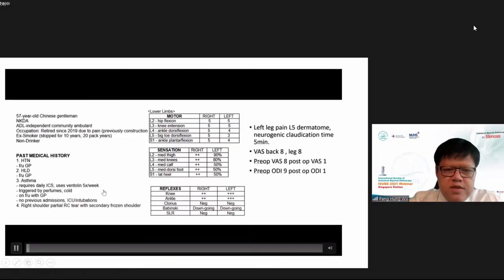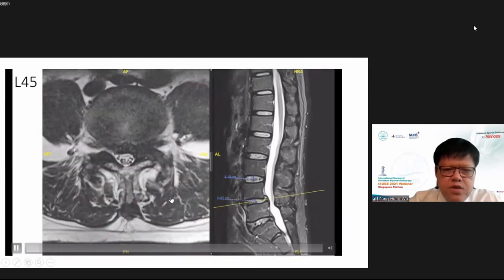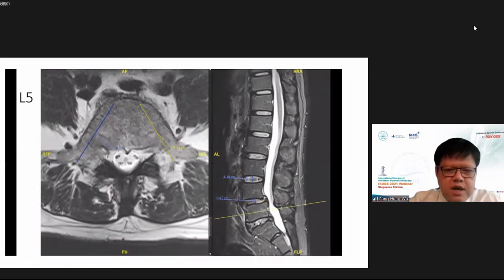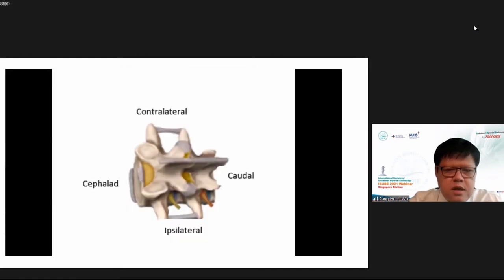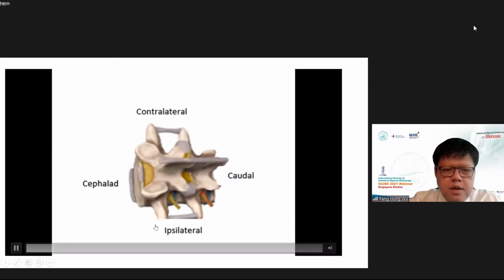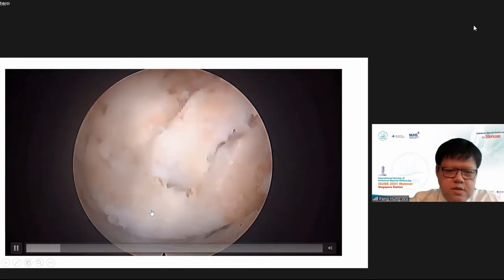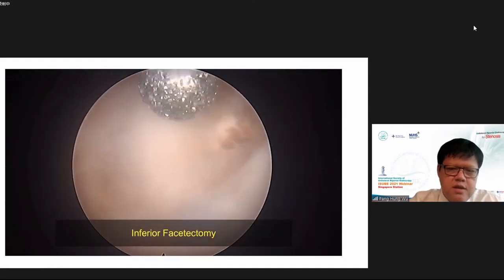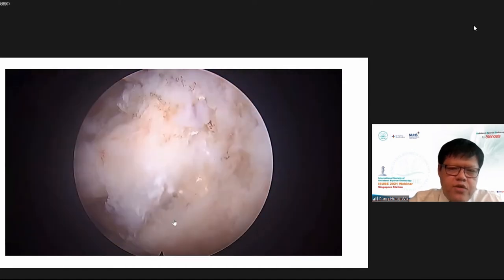A 57-year-old man with significant back and leg pain. Spondylolisthesis at L4-5 with foraminal and extraforaminal stenosis. We measured the pedicle size and cage size. We dock on the isthmus, drill, expose the spinal laminar junction and facet joint — inferior articular process overlapping superior articular process. Then we drill the isthmus across until the inferior articular process is loose.